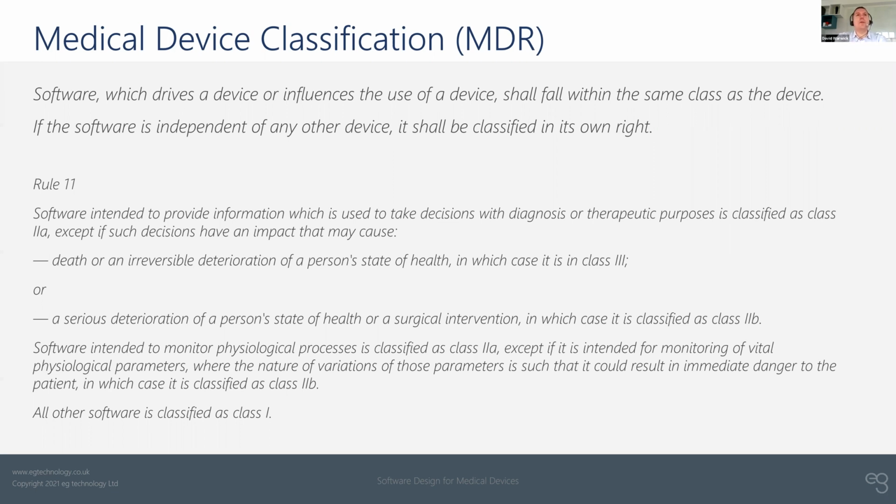I think the mechanics of data gathering and the mechanics by which you continue to improve the algorithm can be relatively well covered. I think the real essence of what they're concerned about is how confident are you that that is having a beneficial effect, and how do you prove it?